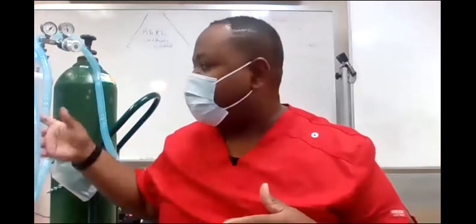Make sure y'all go back and look at this video. It's just a lot of information, but once you got it, you got it. This doesn't change, all right? There's no new setup that you're going to have that you haven't learned today, as far as the high flow devices, except for the machines. You will get to them, which is the ventilator. That's a high flow system because I can set the FiO2. The BiPAP machine, right? Those are all high flow systems. CPAP machine, those are high flow systems, okay?